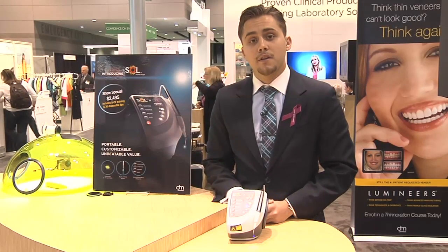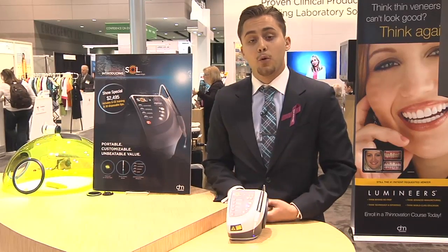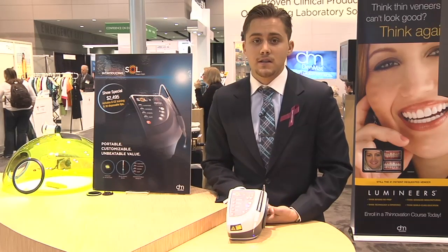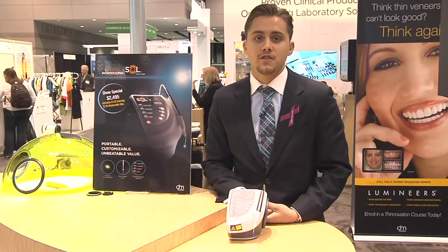This laser is different from the competition because of the portability, because of the blue aiming beam, and because of the value. The Sol laser is the most attractively priced laser in dentistry today.